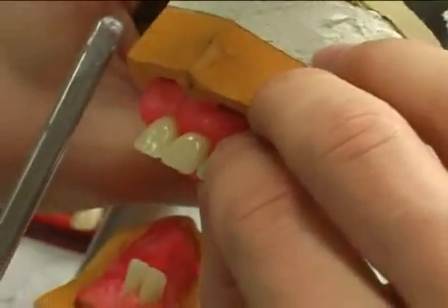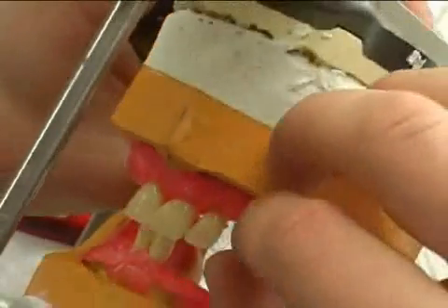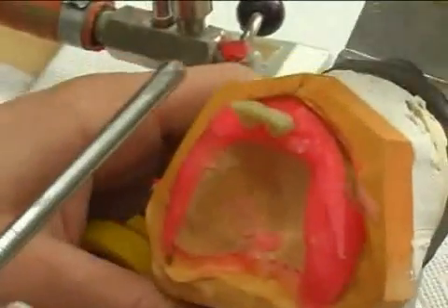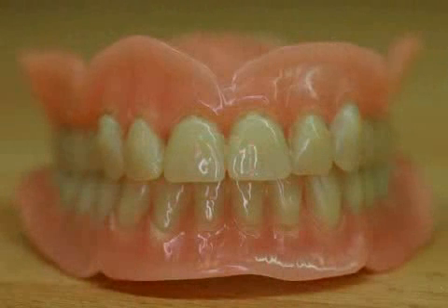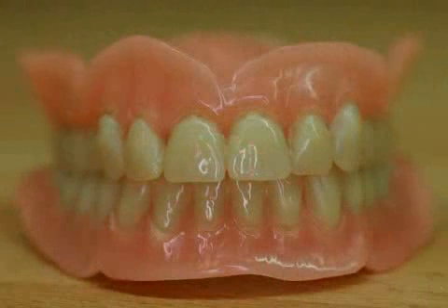When the patient tries on the wax setup, the dentist checks whether the data transmitted by the bite template was correct. The patient must feel comfortable with his teeth. Thanks to the wax setup, the teeth can be moved slightly and the bite can be corrected as needed. It's only when everything fits perfectly that the prosthesis is considered complete.